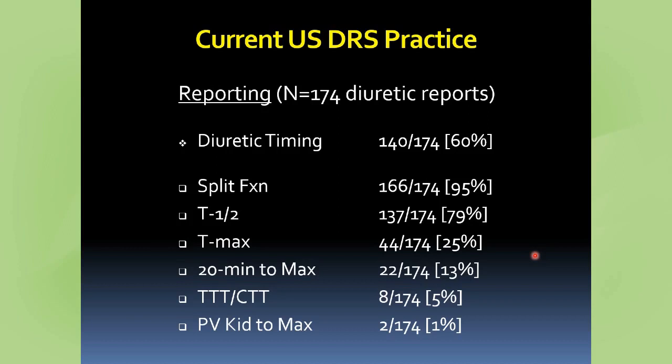One, for our referring provider to take into consideration, as well as for us on follow-up, because certainly the best follow-up will come if you repeat the same protocol, and you have to document that somewhere so that the person who comes behind you knows. Our typical protocol at our institution, we use the F plus 0 in the vast majority, but if it comes from an outside provider and they've had a study from somewhere else, we defer to what the prior protocol said. So we get the report, and if it was F plus 20, we do F plus 20. If it was F minus 15, we do that, because we want to try to get the best direct comparison of our results to the prior results.